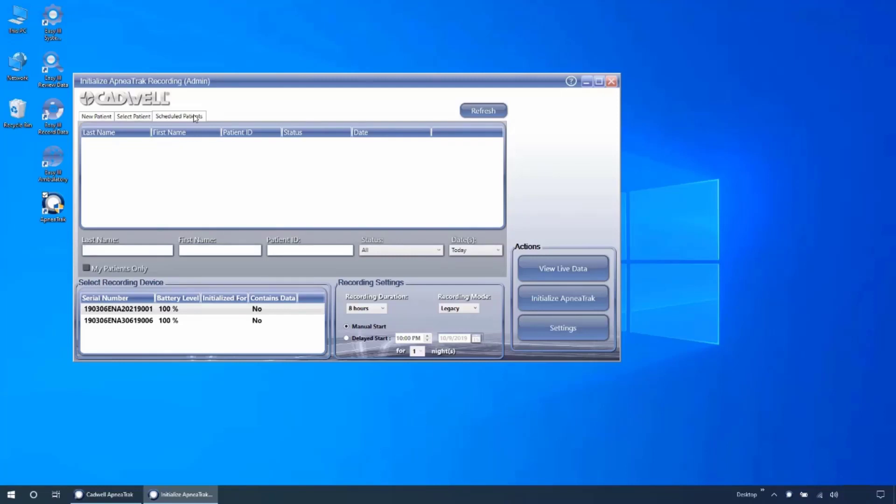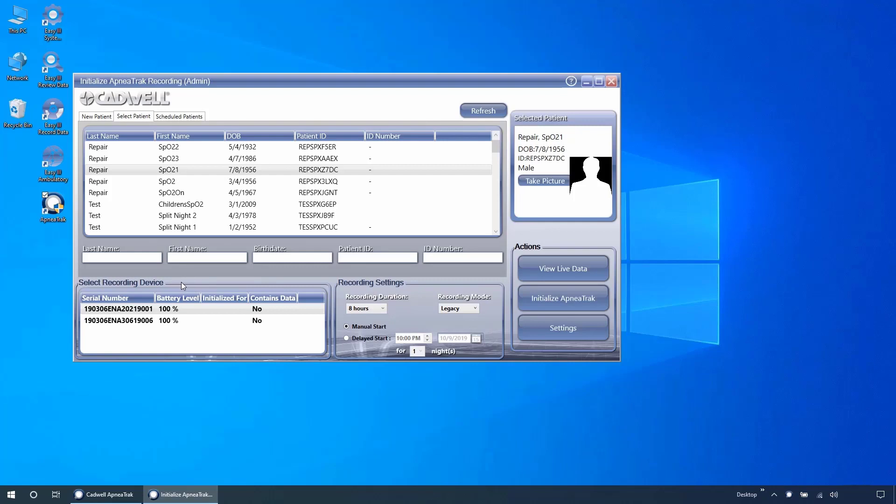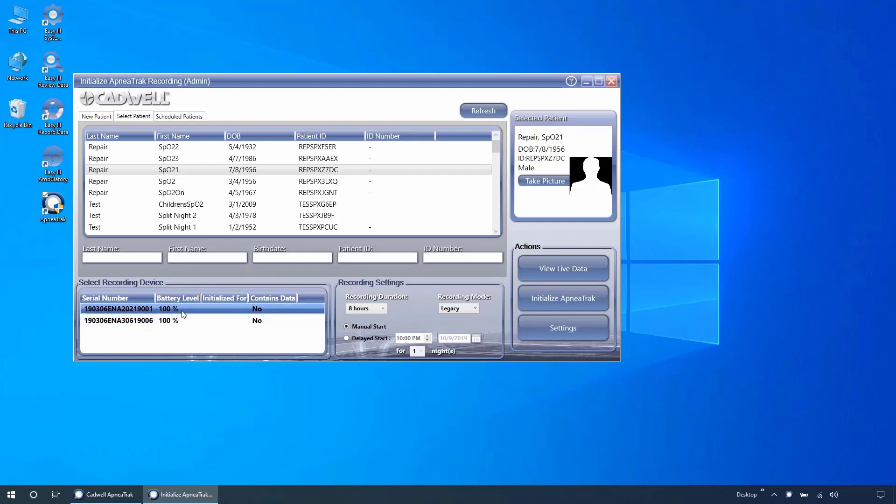The select recording device pane will show all connected ApneatTaks. Each ApneaTrak will display by serial number, battery charge, if the device contains data, and patient name if it has been initialized for recording.